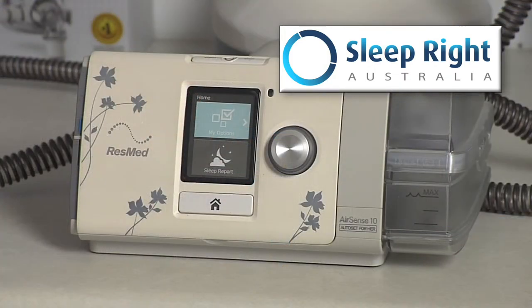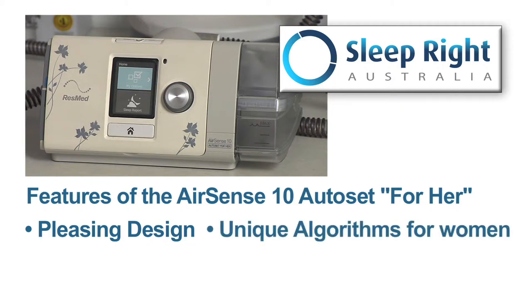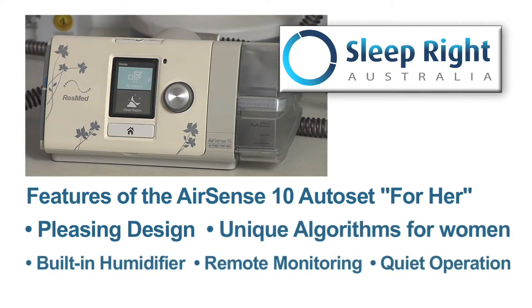Another product that we stock is the ResMed AirSense 10 AutoSet for Her. The AutoSet for Her is designed specifically for women. Yes, it has a different cosmetic design, but the real features of this device are inside the machine.